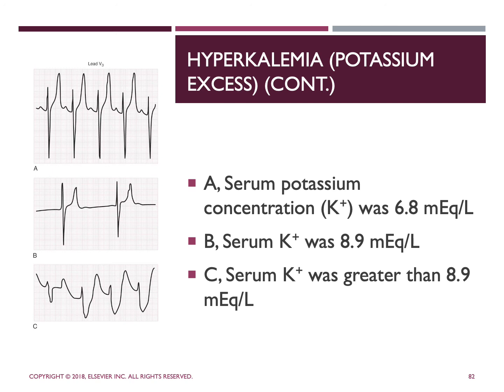So what we're looking at here are the effects of progressive hyperkalemia on the ECG. All of the illustrations are from lead V3 that you're seeing here on the left side of your screen.